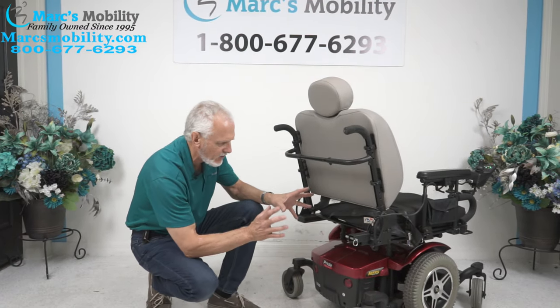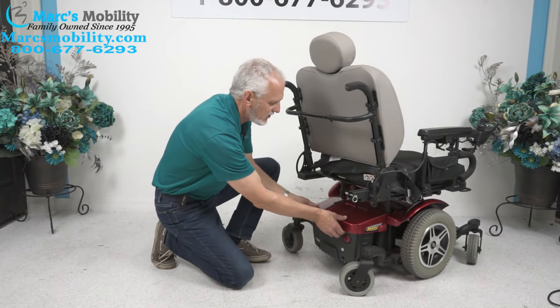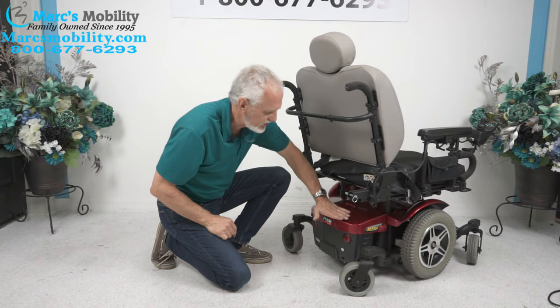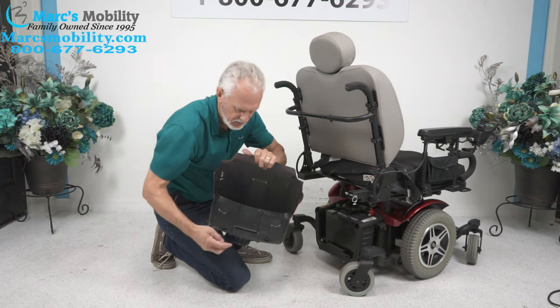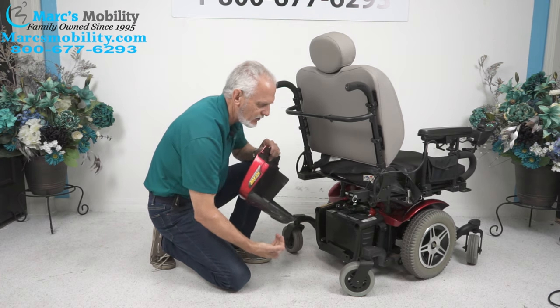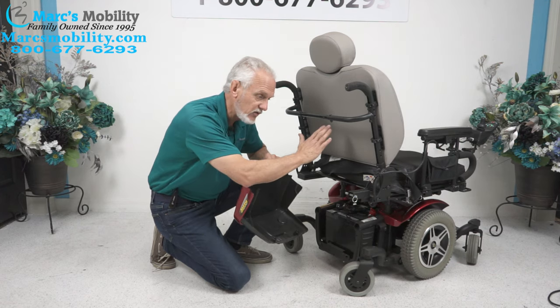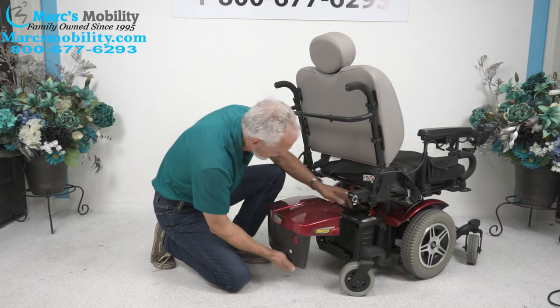The batteries on the 614 and 614 HD come out from the back. As you can see, the cover looks loose but it won't come off unless you know how — you've got to push down, get your fingers under it, and pull the bottom out using two little tabs. The batteries are back to back; there are two at 55 amps. You'll get about 15 miles per charge, depending on the user's weight and whether you're going through grass or sand.